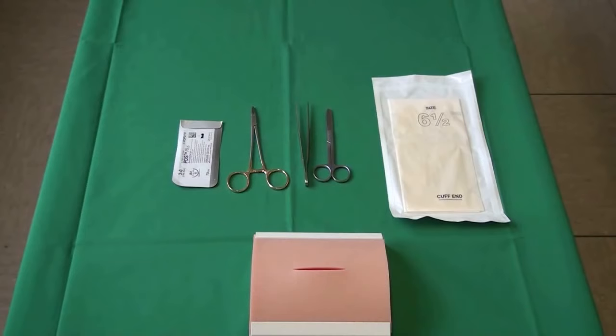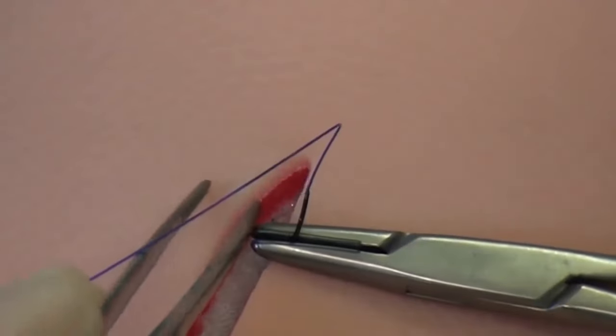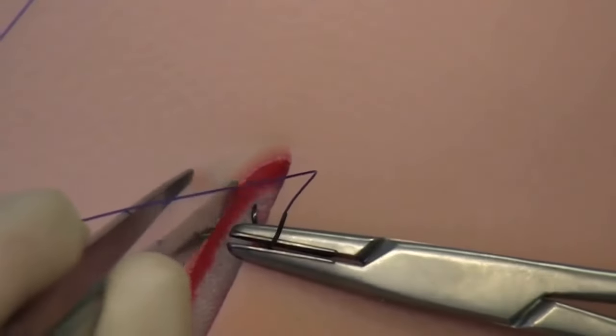The suture pad, as shown here, is intended to simulate the skin, with the red layer representing the subcutaneous tissue.